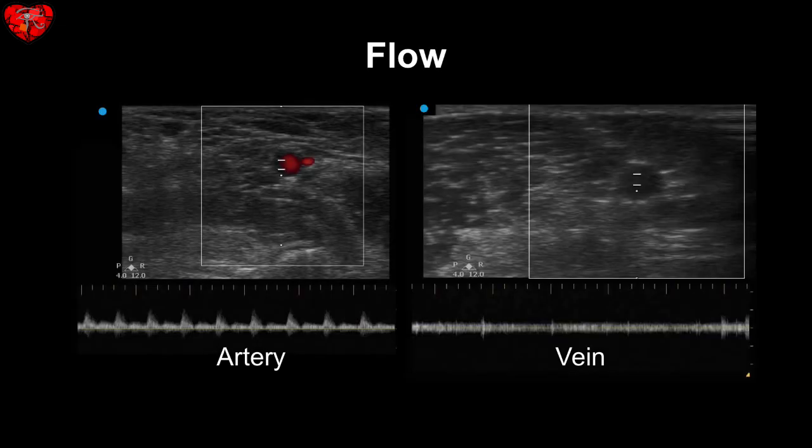With the probe placed appropriately, the flow in an artery appears pulsatile with relatively higher amplitude, which means higher velocity on the scale on the left. The flow in the vein is more smoldering and undulating with lower velocity.